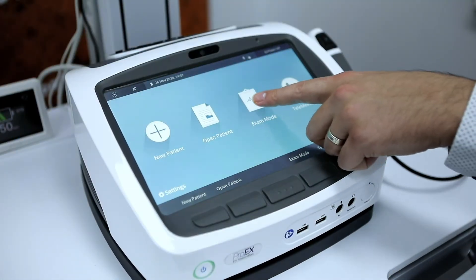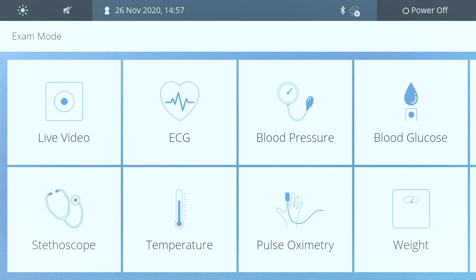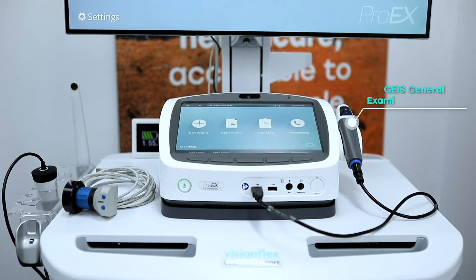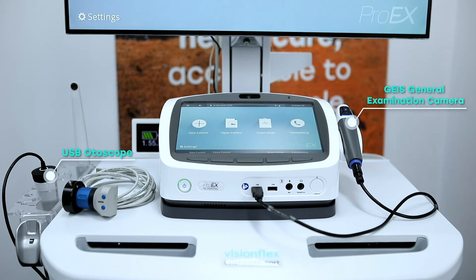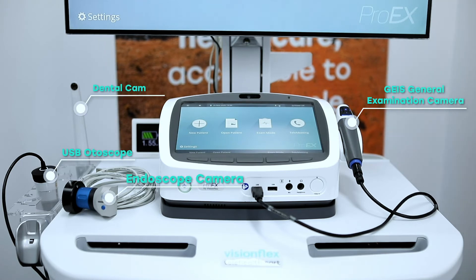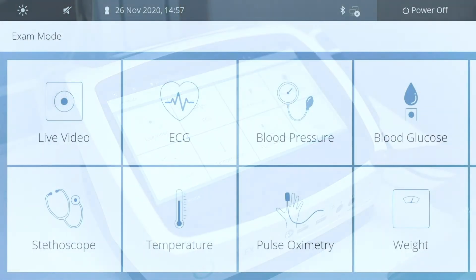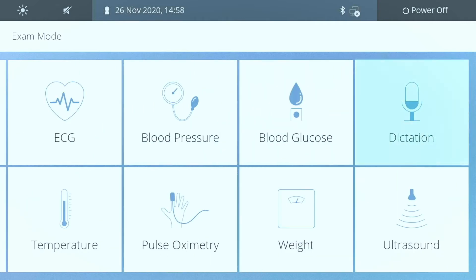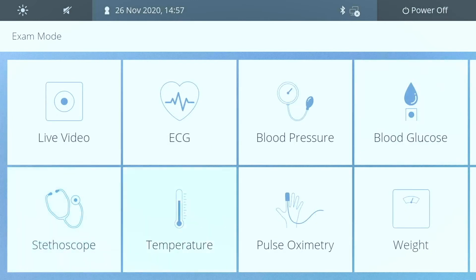Next is our examination mode. Here we can select a number of different tiles. Live video allows you to use various imaging devices such as the GEIS general examination camera, a USB otoscope, an endoscope camera, or a dental camera. Other examination modes include ECG, blood pressure, blood glucose, dictation, stethoscope, temperature, pulse oximetry, weight, and ultrasound.